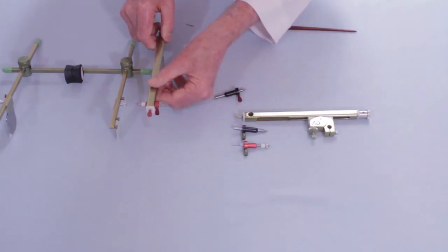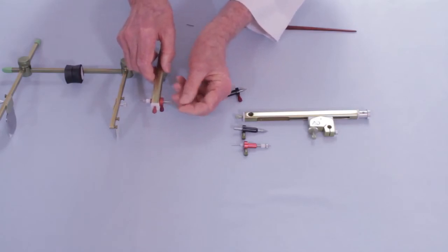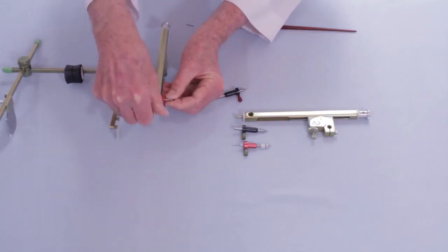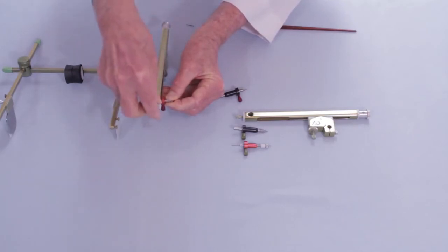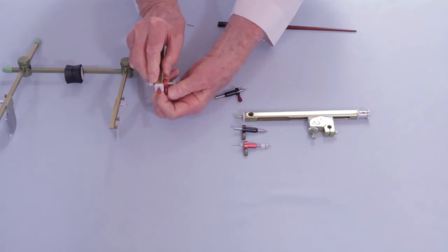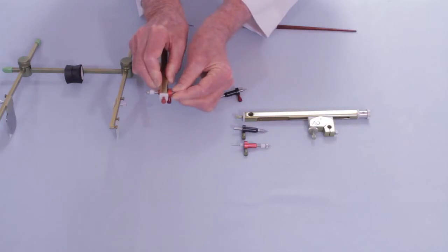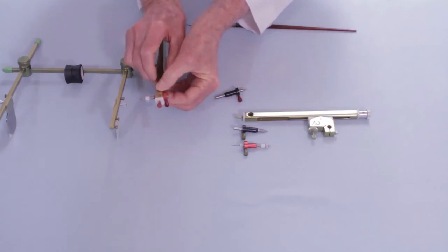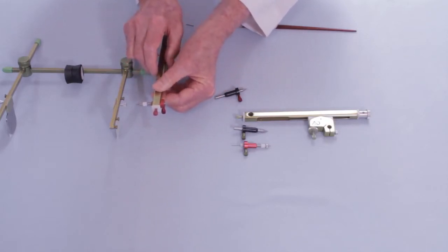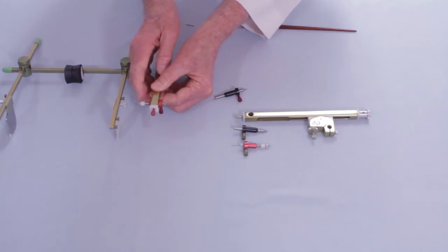And now when you get ready to do the actual writing on the patient, you hold the writing pencil here, release the spring, and gradually let the writing pencil go in until it touches the flag, and now the patient can move and do the recordings. And the spring, being spring-loaded, will keep the lead against the flag so that you'll get a recording of all the movements.